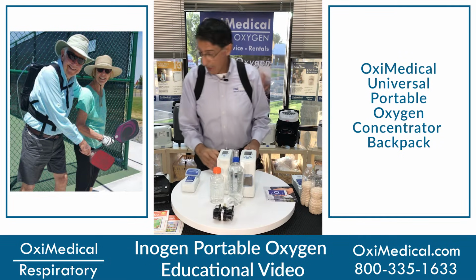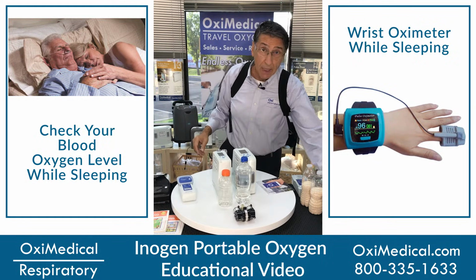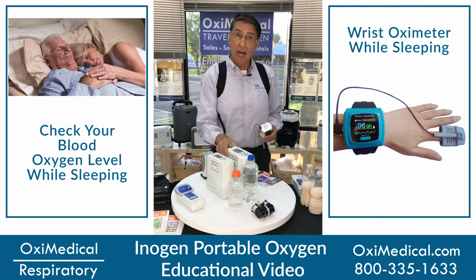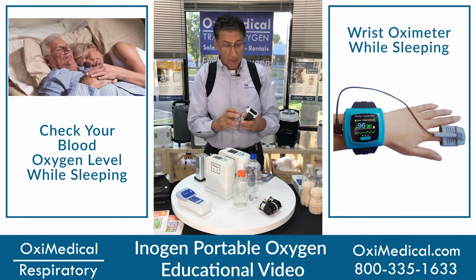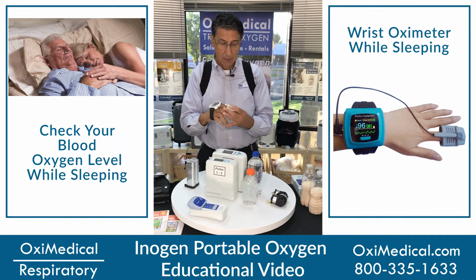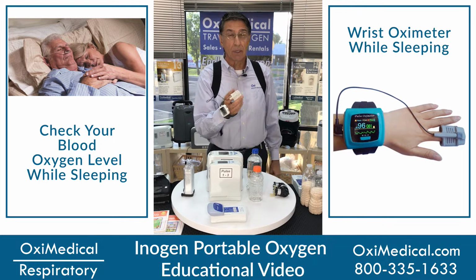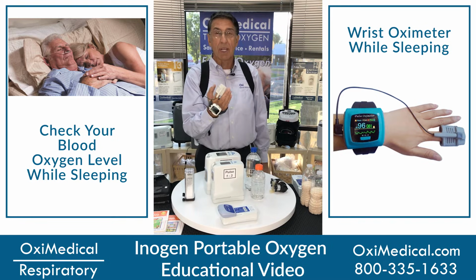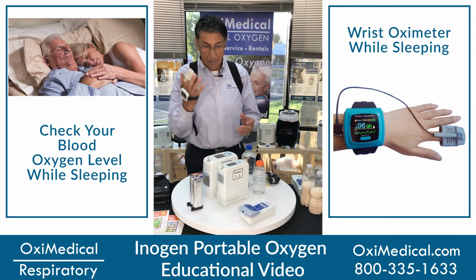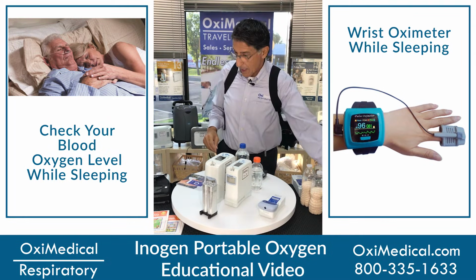The Inogen also can be used while you're sleeping. I recommend, if you plan on sleeping with the Inogen product, the G5, more oxygen. I also recommend that you use a wrist oximeter. You can set this for 90%. Always check with your doctor to make sure if you can use the Inogen at night. A wrist oximeter will wake you up if you go below the 90% threshold. Very handy device, less than $150.